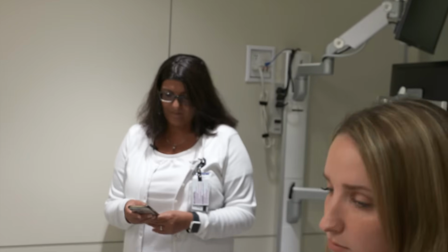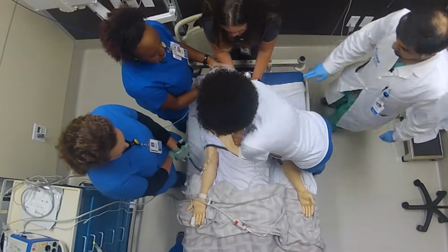Hey, Dr. Khan, I'm the code RN. We just shocked him at 150 for a VFib arrest. He looks to still be in VFib. The last shock was delivered a minute and a half ago. Thank you, Brittany. Have we given any meds yet? No meds yet. We do have IV access.